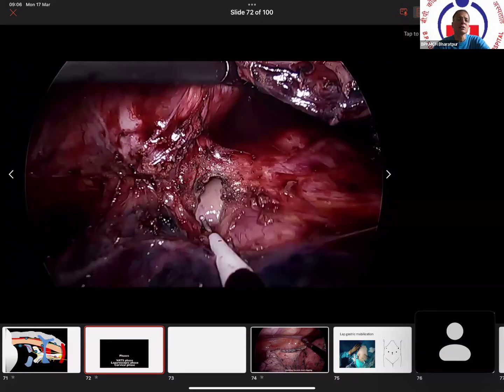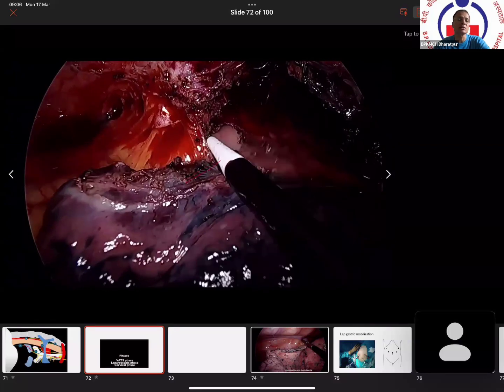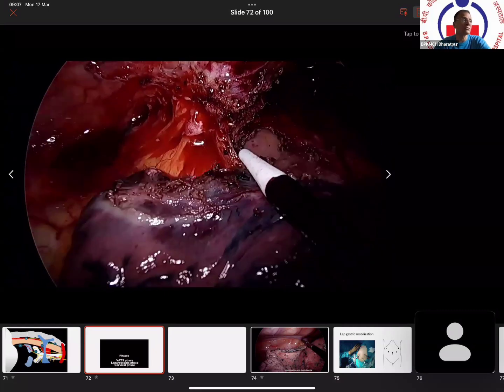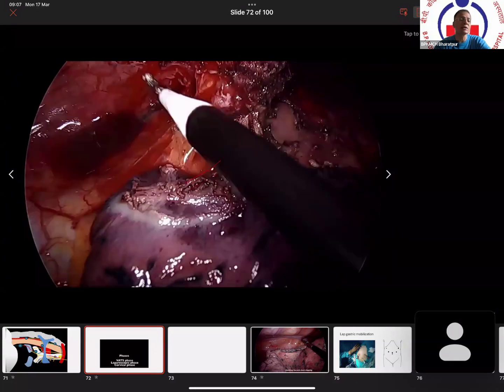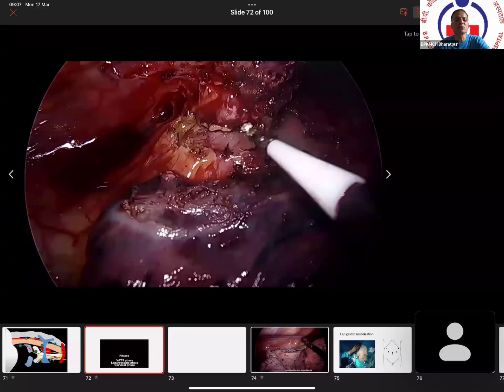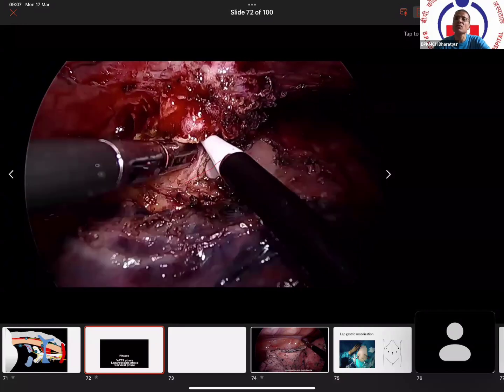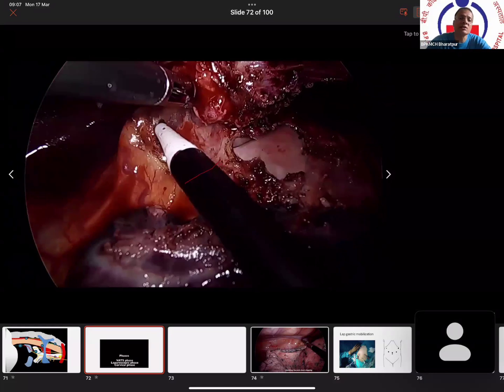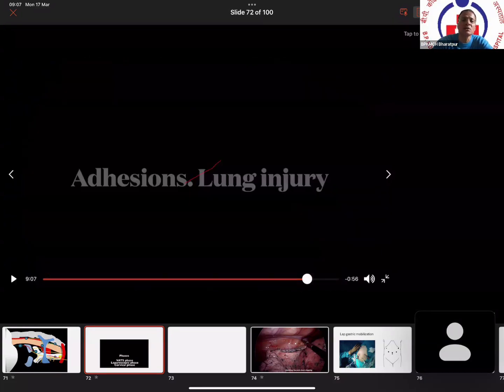It's not true that we cannot do it with minimally invasive surgery. I think in such cases of esophageal cancer, MIE is better than the open approach. We have better exposure. We do not compress the heart with our hands. So that is one of the most important advantages of MIE. If we convert the patient to open surgery, some of the assistants need to compress the lungs and also compress the heart at the same time. It may cause some cardiac injury, arrhythmia, etc. during the surgery. So this is one of the good choices during the surgery.